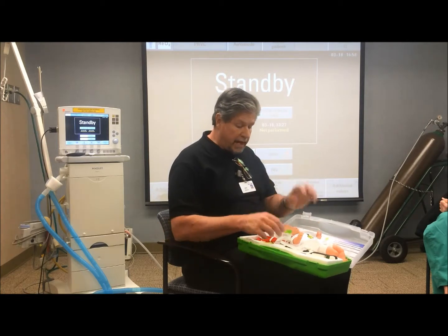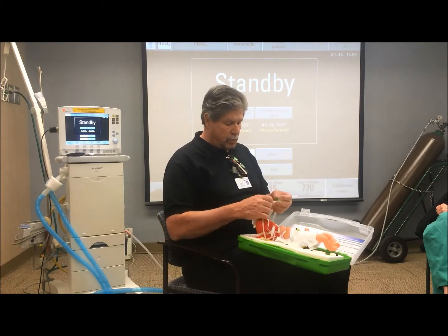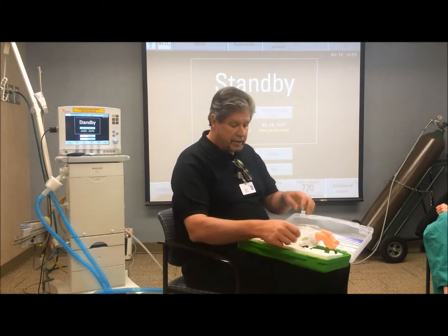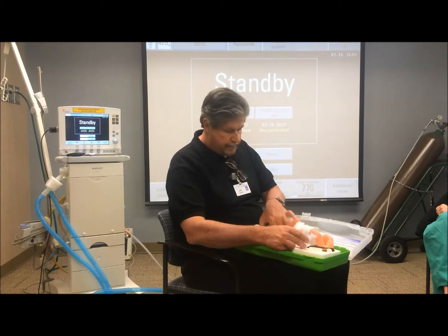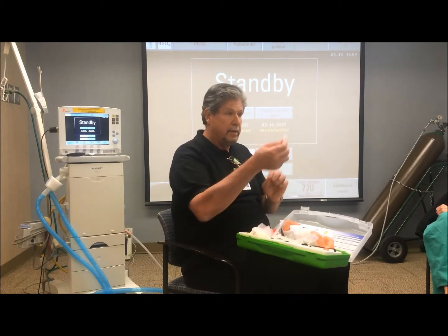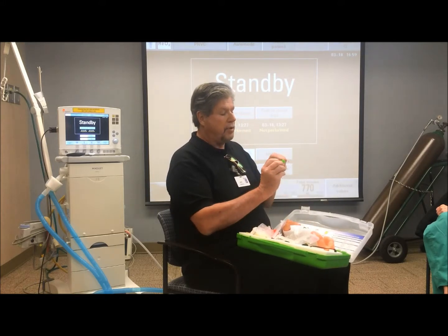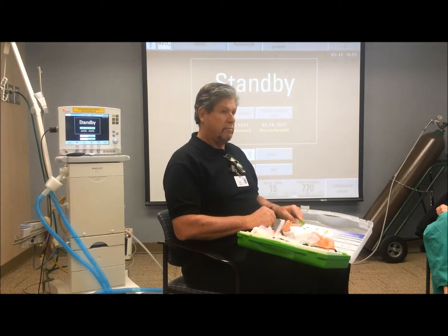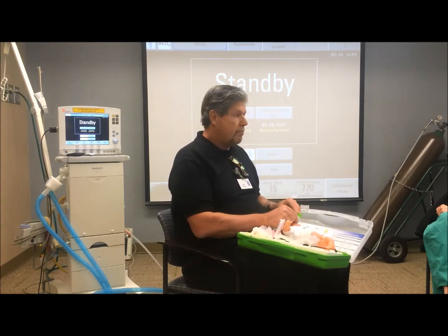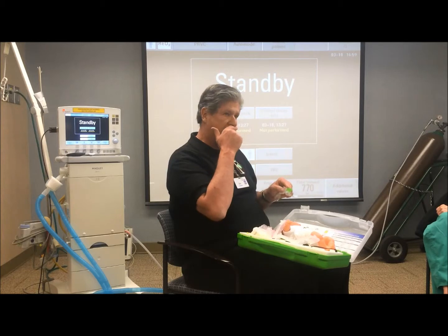Okay. And then what I didn't mention is, I think one of the nurse practitioners yesterday said, oh, well, this will work, and what we can do then is alternate every 4 hours between prongs and the nasal mask. So if you see some breakdown occurring, you can simply take the prongs off the mini flow and then put the mask on. And then 4 hours later, you can save those prongs that you took off and then put them back on, and then use the prongs. So you can avoid or minimize the amount of breakdown that you might see at the nose.